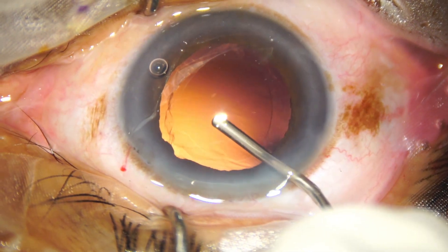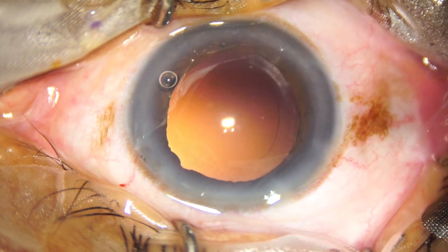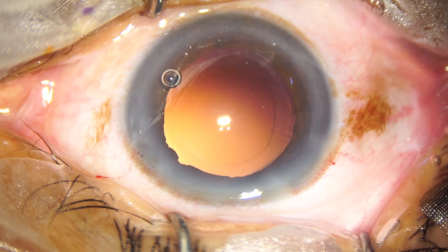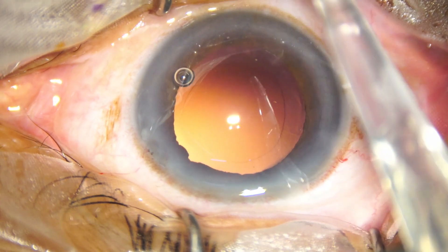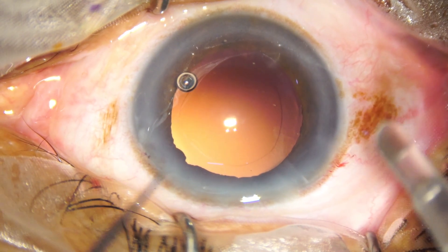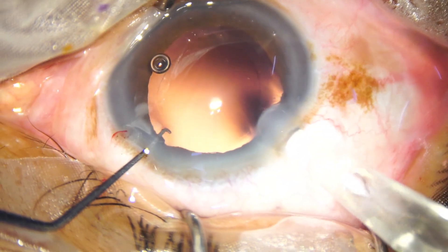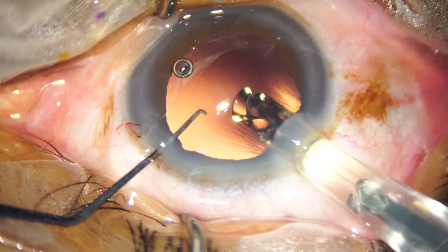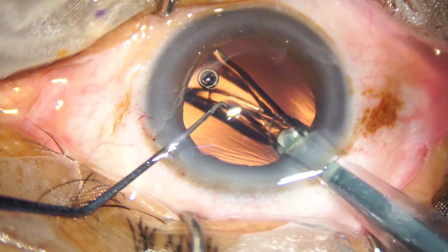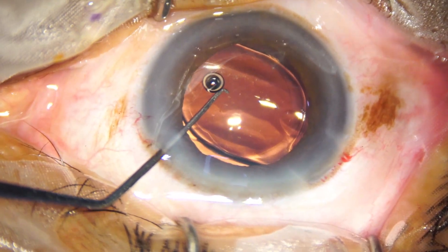The bag is filled up with viscoelastic. Now, a hydrophobic acrylic single-piece monofocal aspheric intraocular lens is implanted in the capsular bag. This is a C-cartridge, and we need not enlarge the main wound when we use this cartridge. Both haptics have gone into the capsular bag.